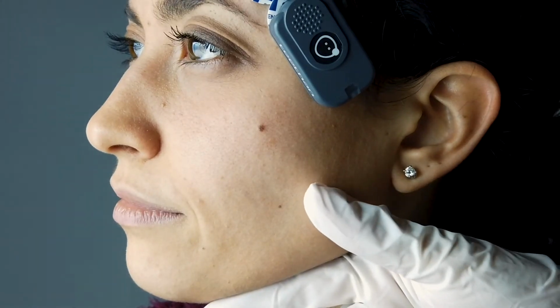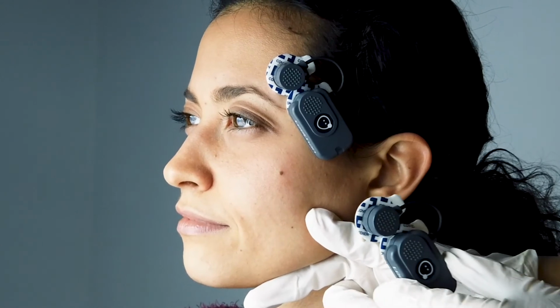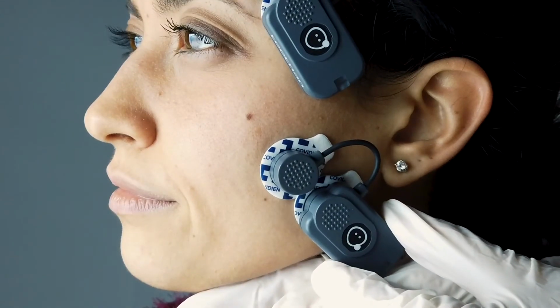To detect the masseter, palpate the muscle and again ask the patient to clench. Apply the probe parallel to the muscle fibers in the central portion of the muscle along the line which joins the lateral corner of the eye with the mandibular angle.